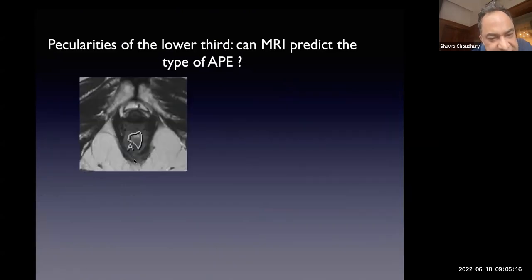So this is in the setting of rectal cancer as far as the fistula anatomy is concerned. So the gray is the internal sphincter and the blacker one is the external sphincter going towards the symphysis pubis. And you will see a thinner column of the anterior component of the sphincter. So this is the sphincter anatomy. And as you go upwards, the external sphincter, the puboanal sling component, will merge imperceptibly with the levator plate.